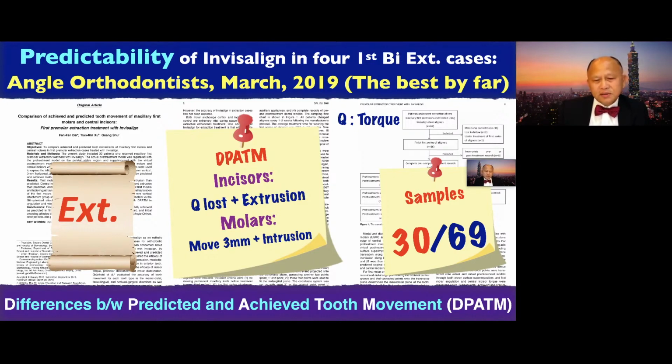In the molar, you have anchorage loss and intrusion, because the aligner covers the posterior occlusal surface. That's why when patients bite with aligners, they intrude the posterior. And it is very difficult to intrude the incisor, the other way around. So keep in mind: torque loss and extrusion for the incisor, and intrusion and anchorage loss for the molar.